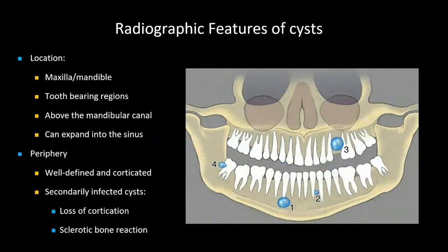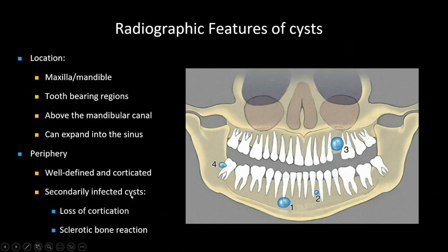Typical features of cysts: they're in the tooth-bearing regions, above the mandibular canal, and can freely expand into the sinuses. Most pathologies like to expand following the path of least resistance. A cyst will have very well-defined and corticated borders, but if secondarily infected they can lose that cortication, and we get a more sclerotic bone pattern with typical signs of inflammation.